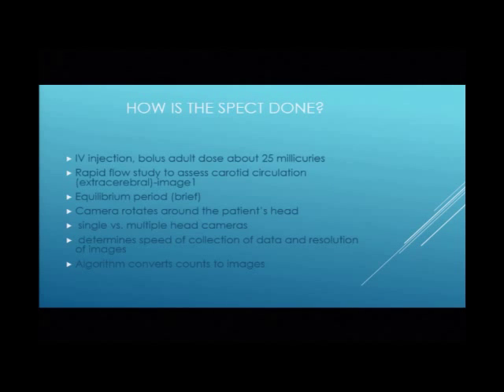Some of this I already said, so I won't repeat it for the sake of time. There are different qualities to the camera that's used. The first set of normal slides I'm going to show you are with an old machine, the first generation, because I have normal ones. The abnormal ones I'm going to show you are more modern, more sophisticated, more sensitive, with much greater capability. And everyone that has gone for that scan has been abnormal, so we don't have any normals of that.